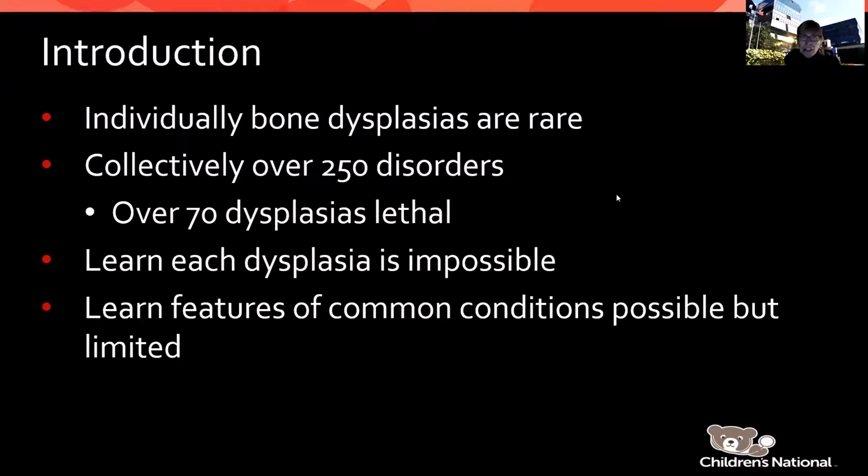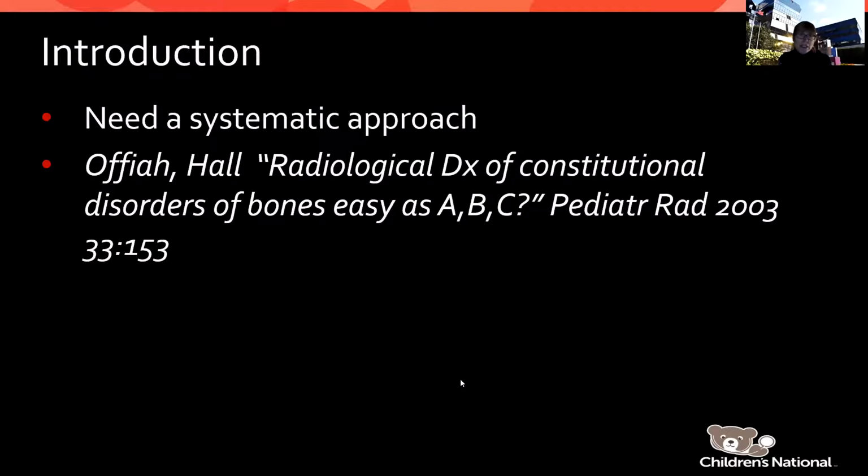So I'm not going to really talk to the experts here about skeletal dysplasias, but it's really hard, and why the radiologists are so worried about them is that there's so many and they're so rare. So it really becomes a double-edged sword. We learn by looking at 10,000 films. We learn by repetitive looking at abnormalities, and we don't have that luxury with the skeletal dysplasias.